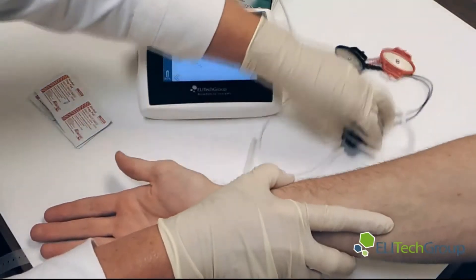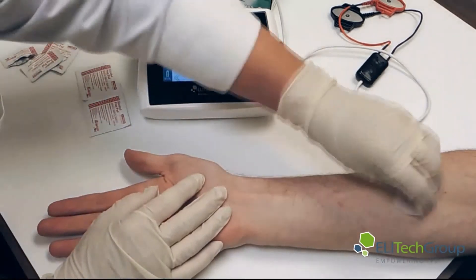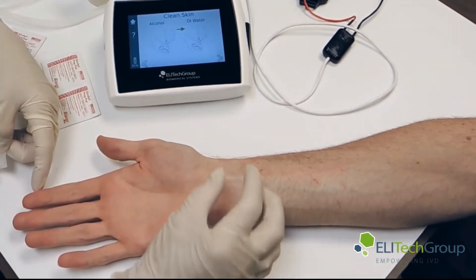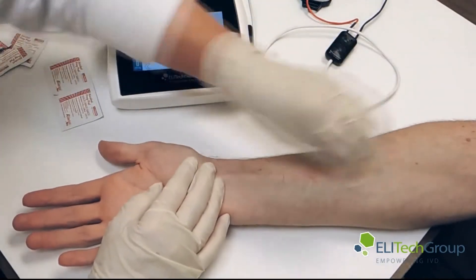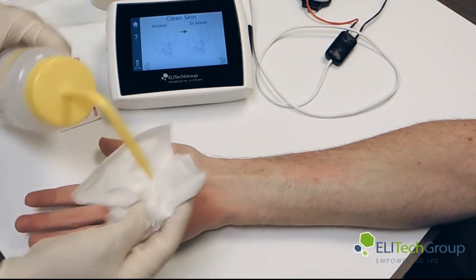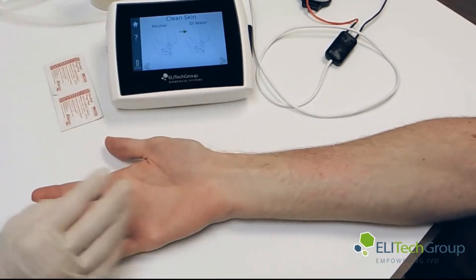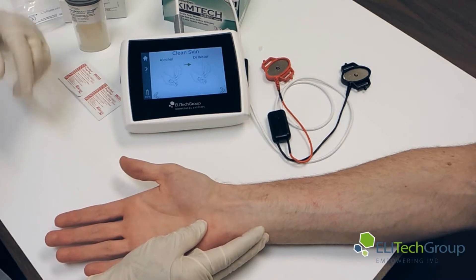Now what we're going to do is clean the arm and get it ready for the iontophoresis testing. First we recommend cleaning with alcohol. We want the area down towards the lower part of the arm — away from the tendon area, because the MacroDuct can't get a nice seal there. We want to be up in more of the fleshy area. We rinse with water following the instructions, so we have a clean area large enough for the MacroDuct Advanced's red and black electrodes. We've cleaned it with alcohol and deionized water, and will now move on to attaching the electrodes.